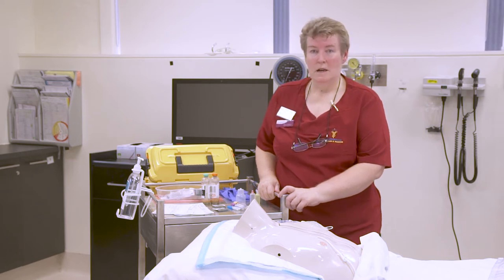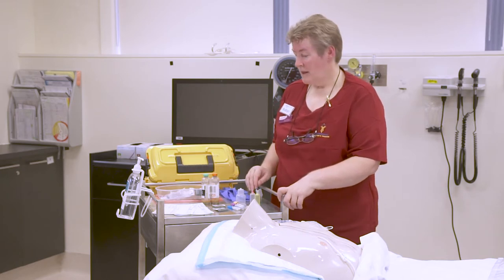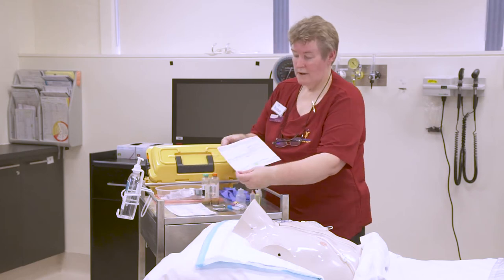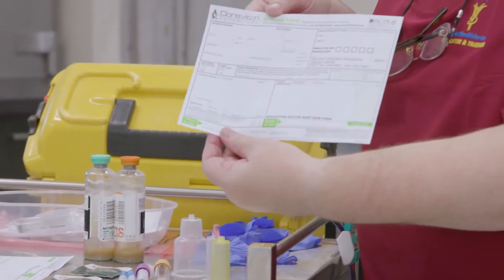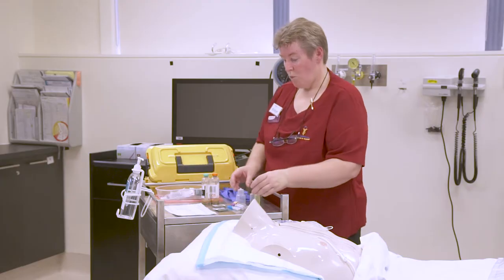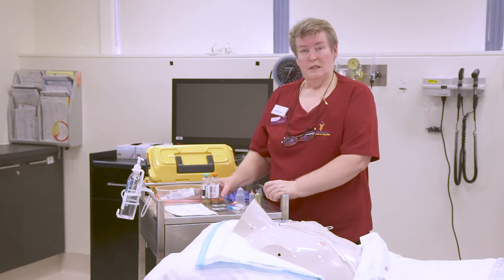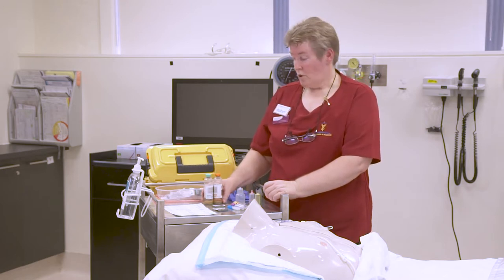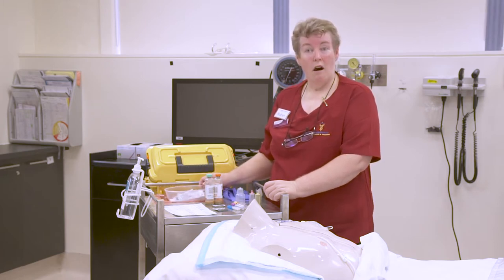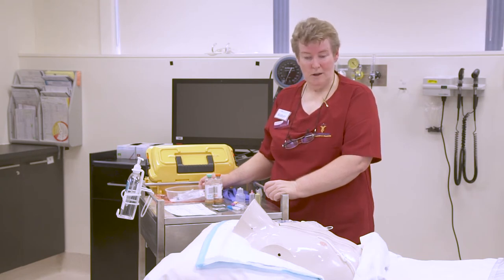as a PICC. So first, what we need to do, of course, is clean our trolley and assemble our equipment. We do need to have an authorised pathology slip from the doctor in order to establish what kind of blood tests we're going to do. And we do need to collect in order of draw, which I'll talk about. Because we are actually accessing the central line, we do need to flush following the procedure.